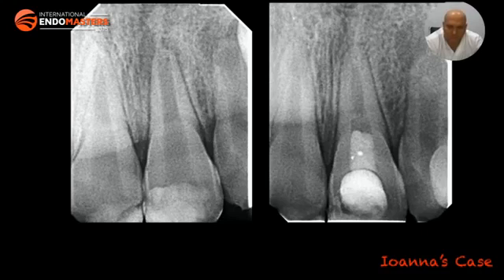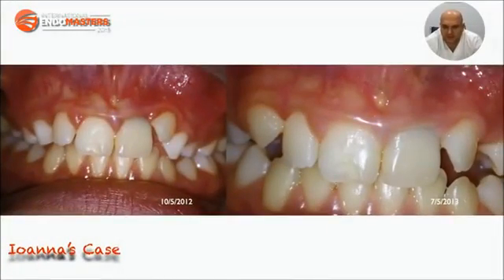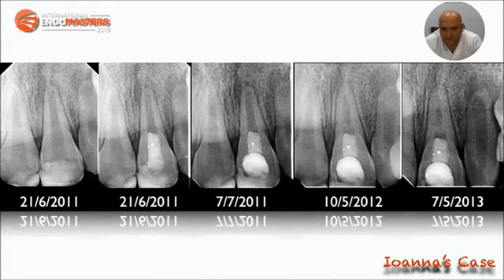Although continuous root development is not that evident, dentin wall thickening is evident. This is the 1-year follow-up. 2 years later, clinical examination revealed healthy, soft tissue, no sinus tract present, no periodontal probing depths and barely detectable cervical discoloration. You can see at the cervical area of the left maxillary central incisor the grayish discoloration over there. And this is the comparative radiograph of this case.